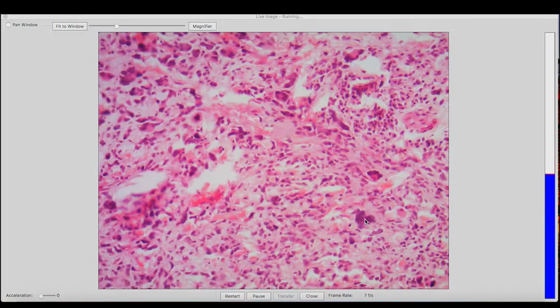Sorry about that. What I'm trying to show you here is actually a very difficult example of a pleomorphic lipoma. That might even be a mitotic figure. You can see some mitotic figures in pleomorphic lipomas. One thing that's missing from this particular pleomorphic lipoma is the very ropey eosinophilic collagen that is pretty characteristic of pleomorphic lipoma. So the bottom line is you've got an atypical neoplasm here with some fat and some hyperchromatic nuclei, including multinucleated cells. Now I'll show you an immunostain.